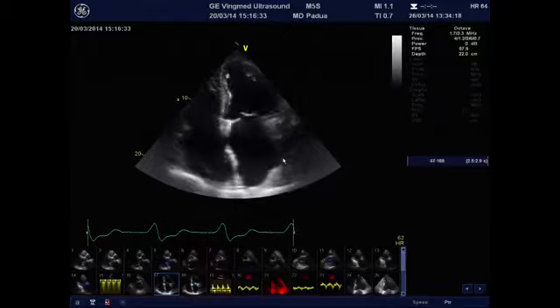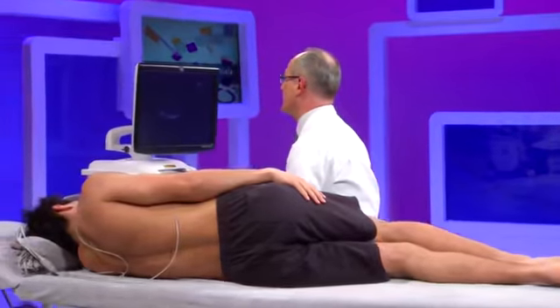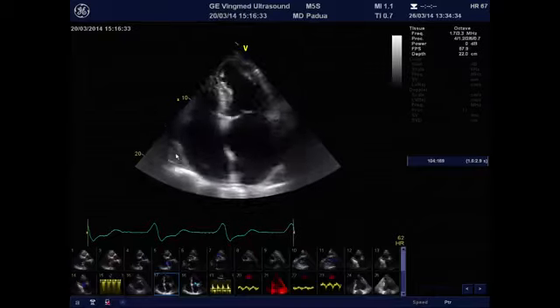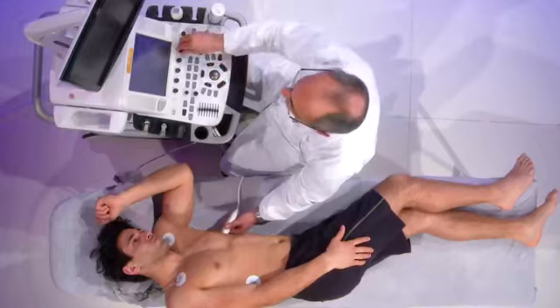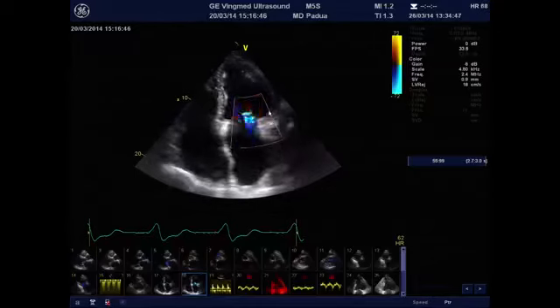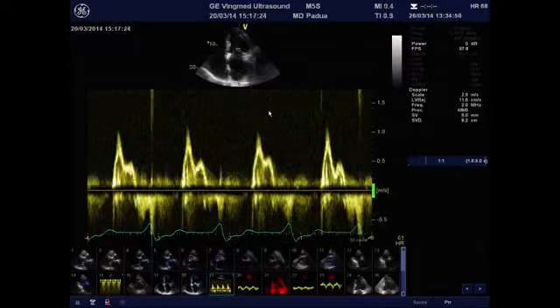This explains these huge atria that are typical of the heart transplant performed with this technique, and also the presence of these suture lines that show you the region where the native atria have been sutured to the acquired ones. And also the four-chamber view provides us an overview of the left ventricular function and the right ventricular function. Then you can turn on your color modality to check again the regurgitations.